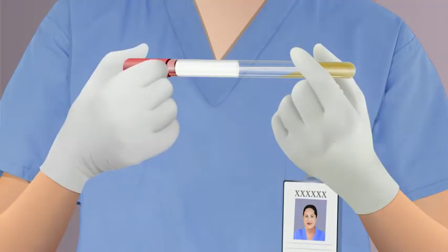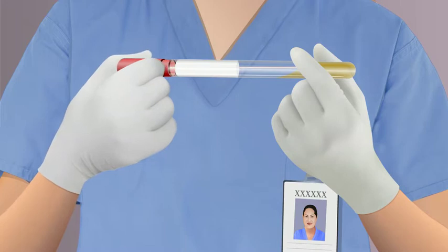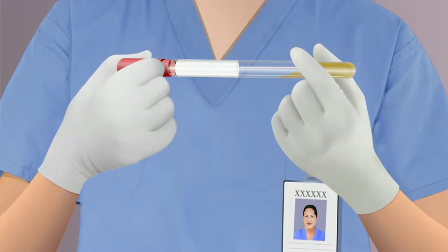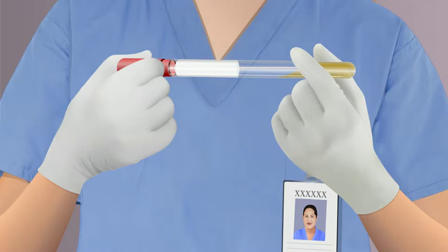Collecting a throat specimen for culture. Have a swab and the culture tube ready for use. If using a pre-packaged culture swab in a tube, loosen the top so the swab can be removed easily.